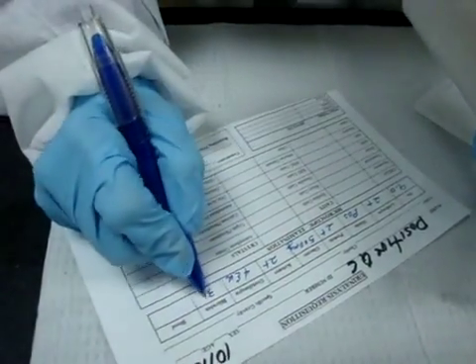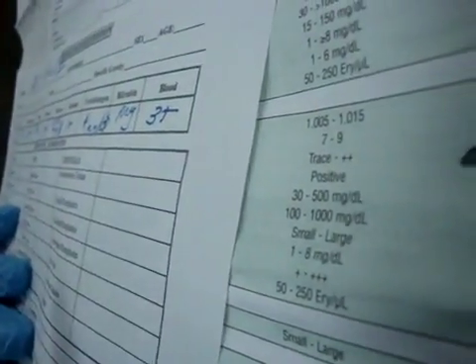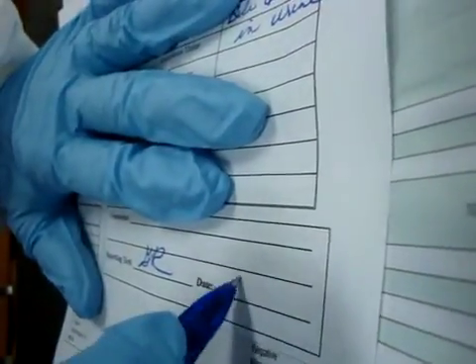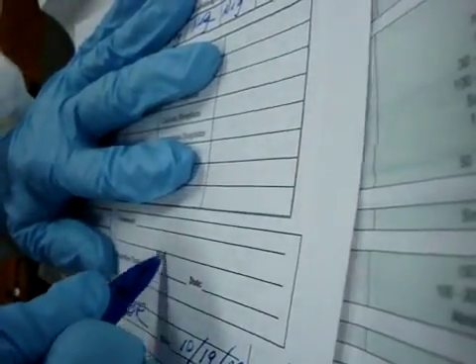Bilirubin was 3 plus. And blood was 3 plus. Now we will compare the results that we got to the results that we were expected to get from the brochure. Then we always want to sign our work and date it. And we want to sign our level 1 and date it.